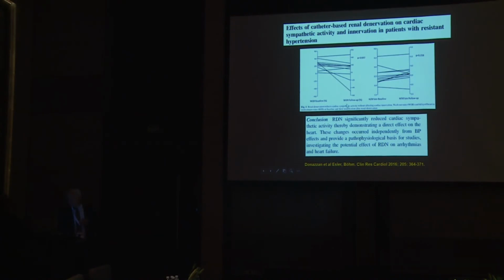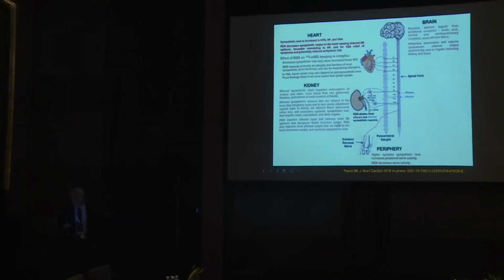Interestingly, there's a technique called renal denervation that they've done for hypertension. But believe it or not, it affects MIBG images. And someone said, we had the yoga thing and reducing problems. It's just interesting that the sympathetic system is all interrelated, and all those things that affect MIBG uptake predispose to arrhythmia. And it just made me think, if we're affecting the afferent impulse to the brain with the yoga, and you're decreasing the sympathetic input to the heart, which you could measure with MIBG, that might be why it's working. So it'd be interesting to see MIBG in response to yoga.